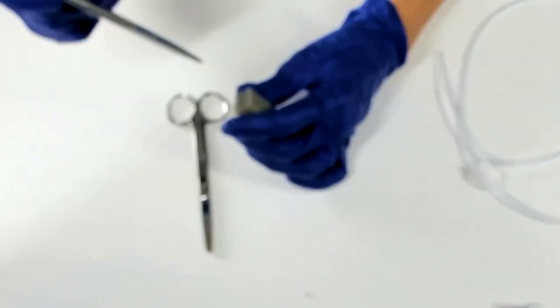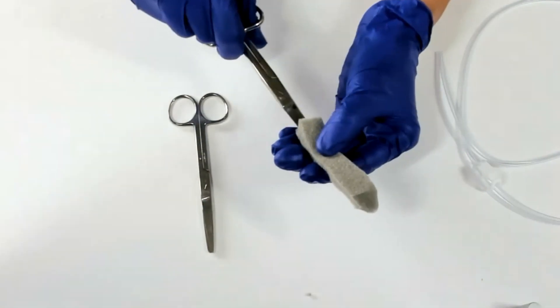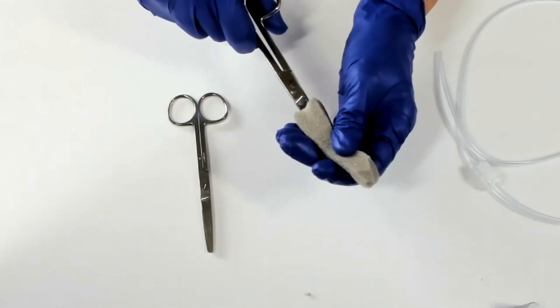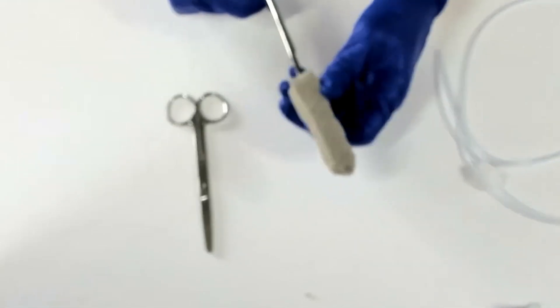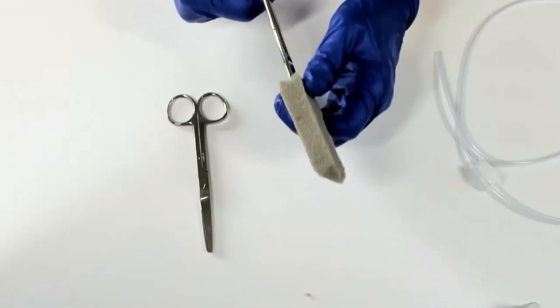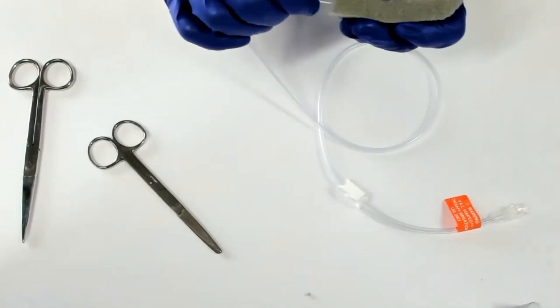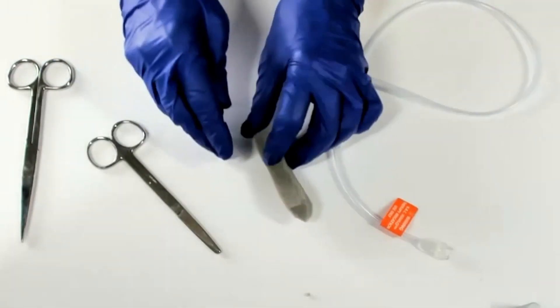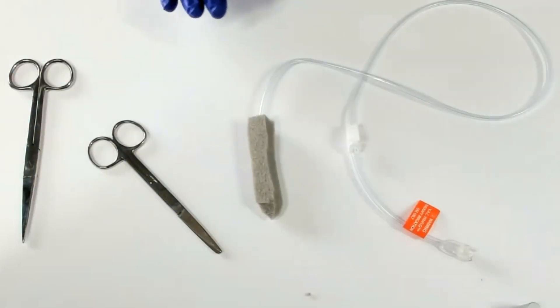Then you're going to take scissors, go into the foam, and clip as you go in. I flip it and clip it mostly because you can get some false passageways, so I keep turning it and reinserting and clipping on my way in. You don't want it to poke out the side — you're really trying to protect that patient's tissue by having it just against foam itself. Then take your little tube and coax it into the foam itself. That's all you need to do. You can tailor the edges to make it perfect for your patient's wound, then put this into the wound and bridge up just like you saw.